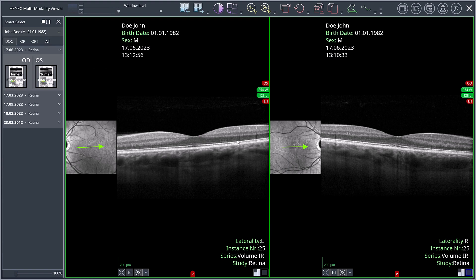When opening the Multi-Modality Viewer, Smart Select will automatically appear at the selected location. In the next step, we want to view further fundus images of this patient in addition to the two OCT volume scans. To do this, select a layout with six viewports via the Layout button.